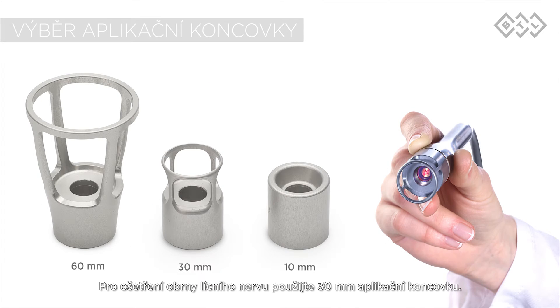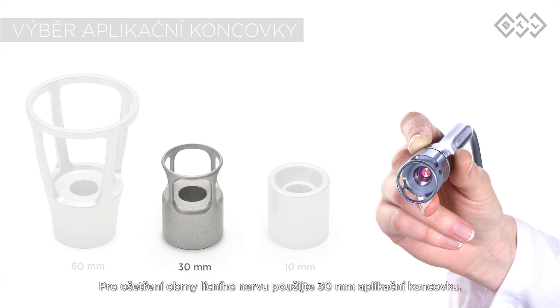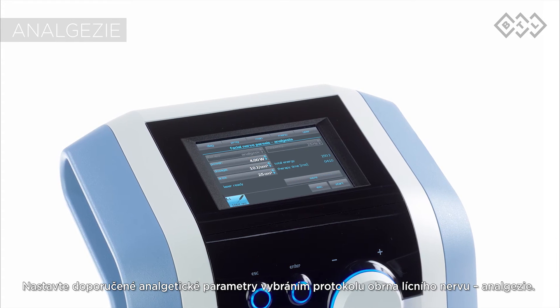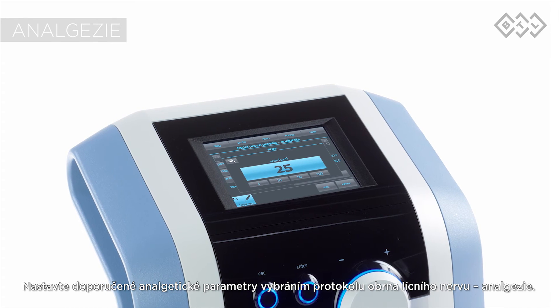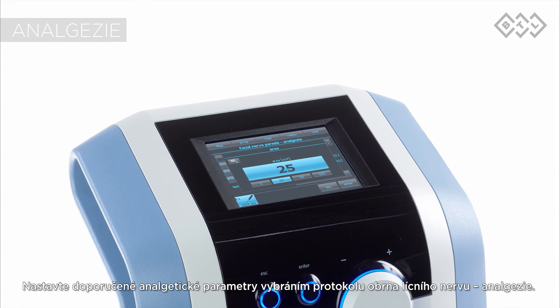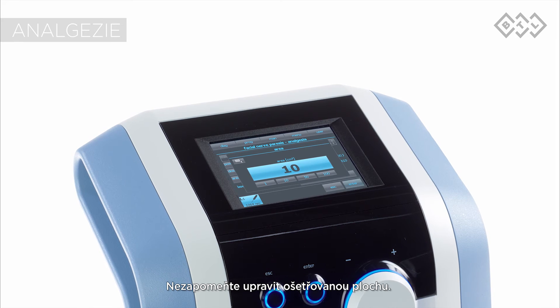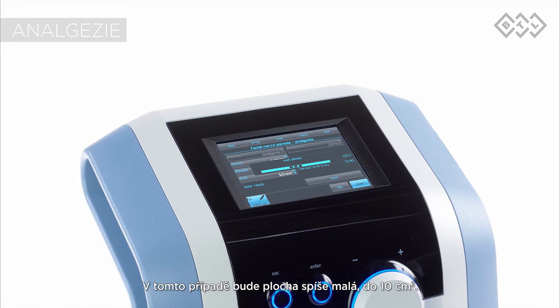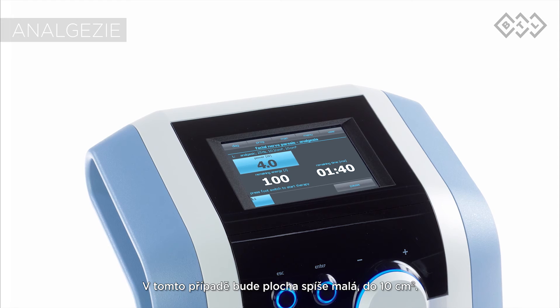For facial nerve paresis, select the 30 mm spacer. Set the recommended analgesia parameters by selecting the facial nerve paresis analgesia protocol. Remember to adjust the area to be treated. In this case, the area will be rather small — maximum 10 square centimeters.